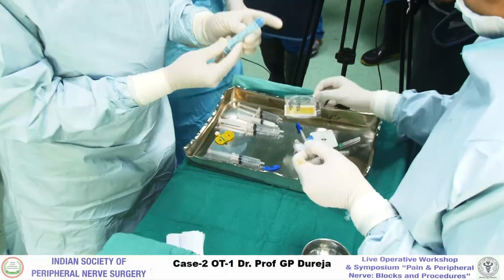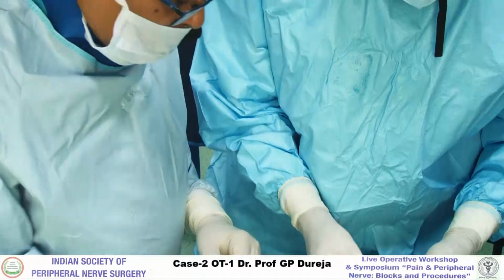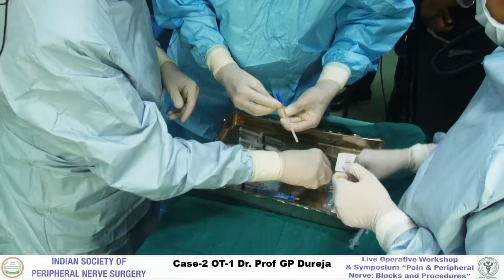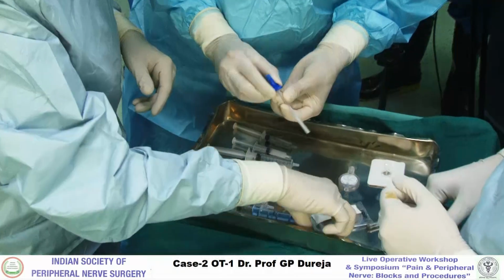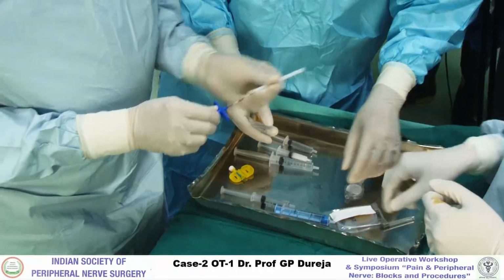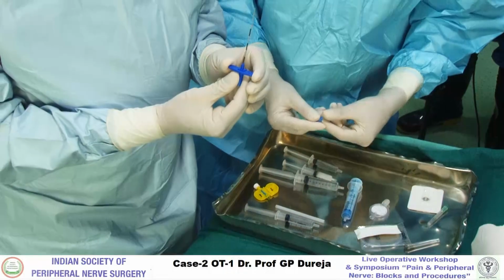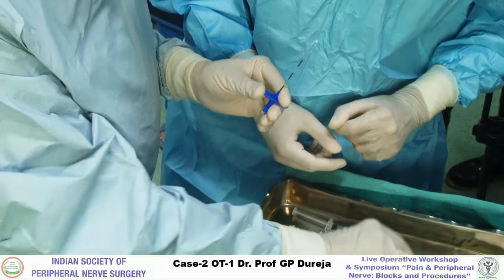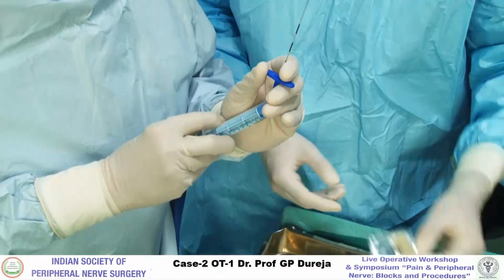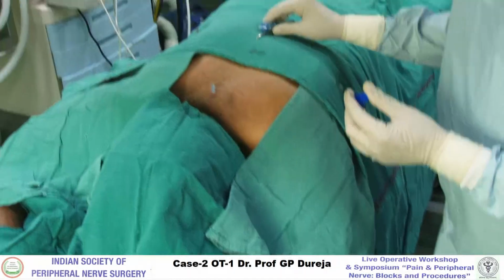So this is a loss of resistance syringe with which we see the epidural space. This is the needle. If required, we have a catheter for insertion. If the dye is not moving up to the desired level, you can use a catheter. This is a standard Tuohy needle, 18 gauge, which we are going to use. And this is the syringe which will help us in finding out the epidural space. Understood, sir. Right. Okay. So we are proceeding.